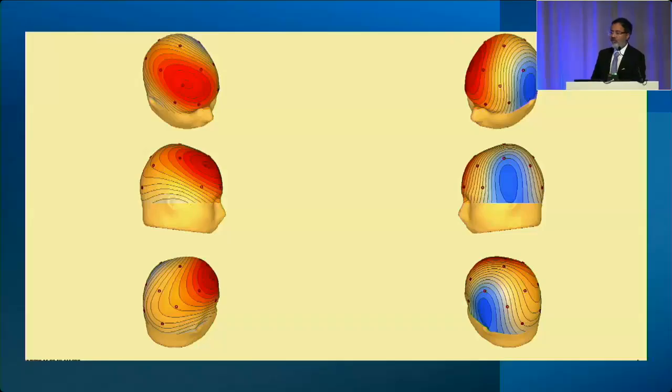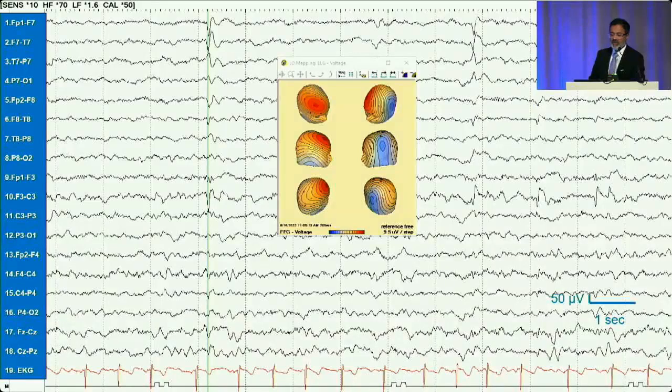So voltage maps are basically what we were talking about before, where you take a maximum point of positivity, and then you draw sequential regions that are less maximum, and it gives us a nice way of understanding the pen deflections. All right, here we go. And sometimes this can be done by the computer by just putting a line on the point of deflection, and it gives rise to this pen deflection here.